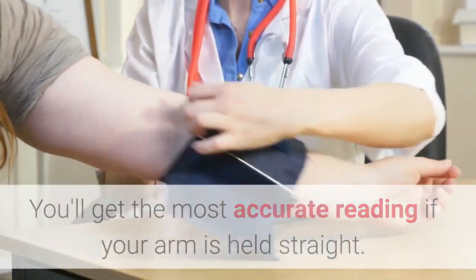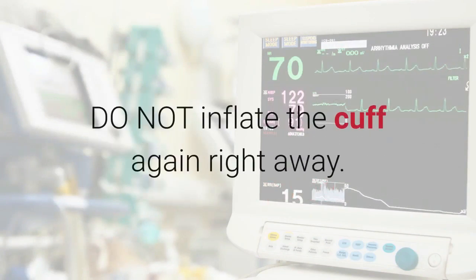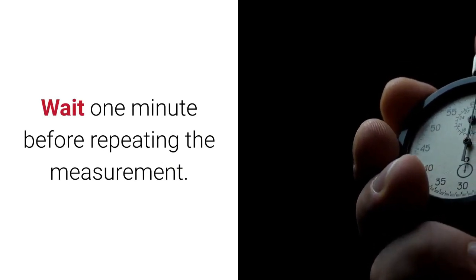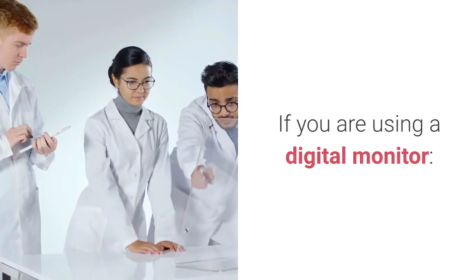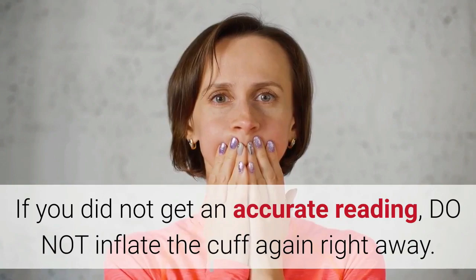If you release the pressure too quickly or could not hear your pulse, do not inflate the cuff again right away. Wait one minute before repeating the measurement and start by reapplying the cuff. This applies whether you are using a manual or digital monitor.